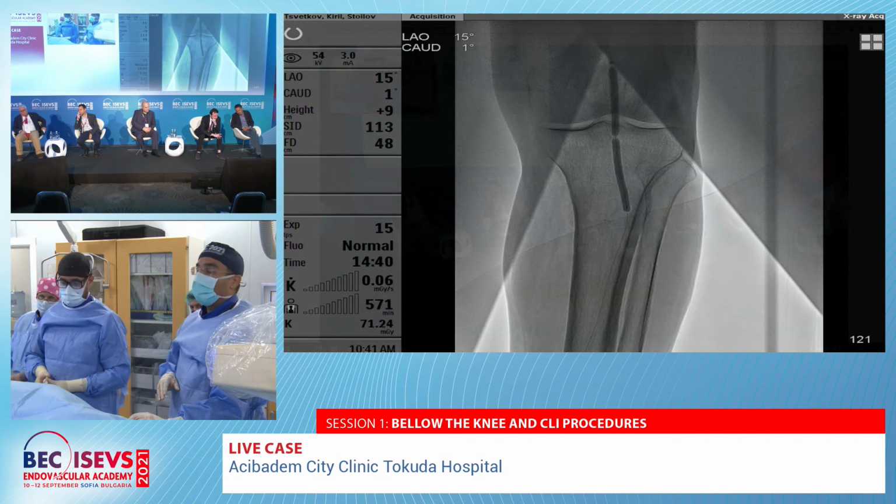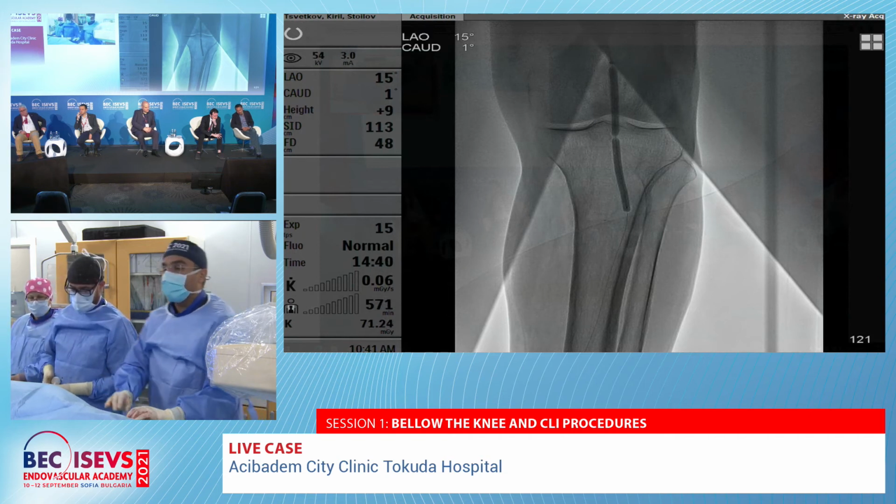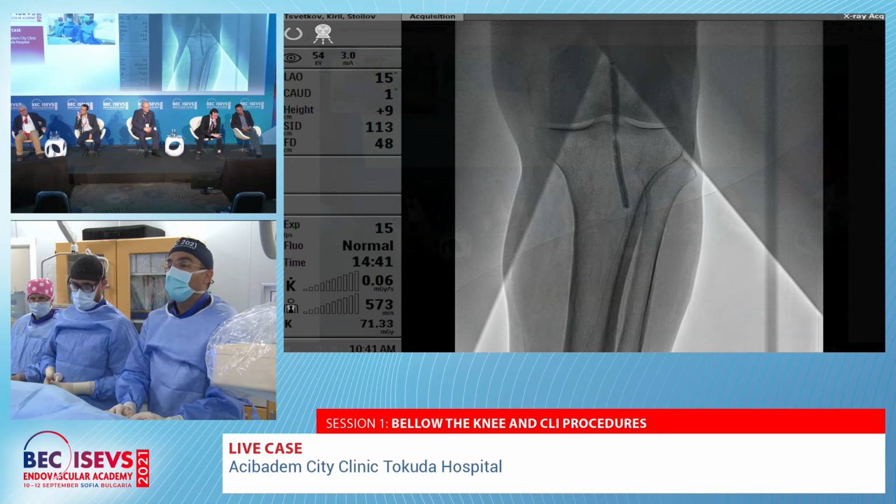Let's open it. Go back and go. We will go back inside. Just a moment. In the middle.